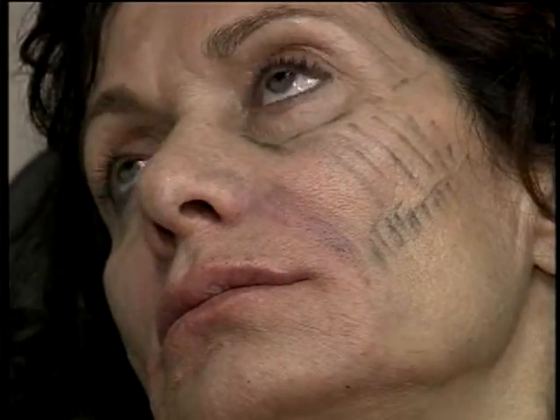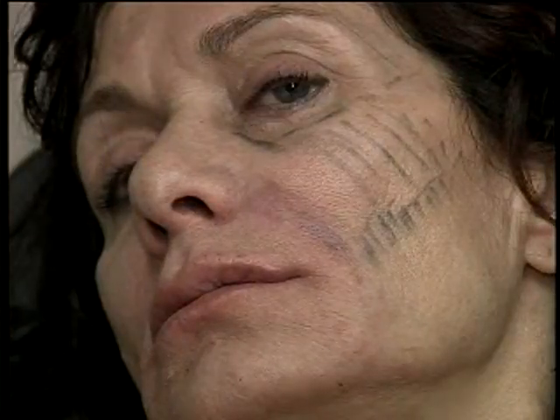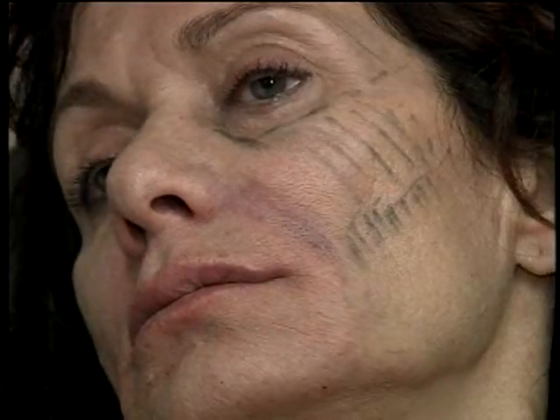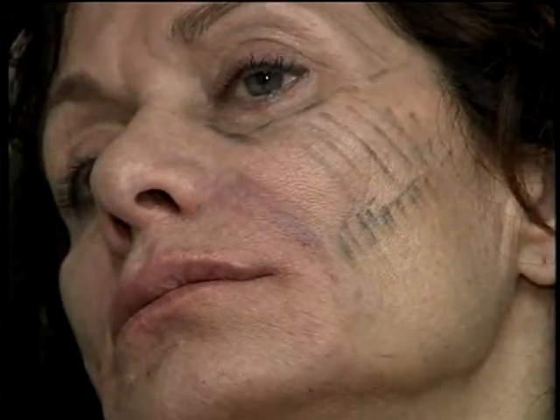Now, there's multiple ways of doing this. It's not anesthetized like the other areas of the face because the nerve block doesn't work in this area. So oftentimes I'll use a topical spray, or something new we're doing is the intraoral approach. So first I'll show you the topical spray.